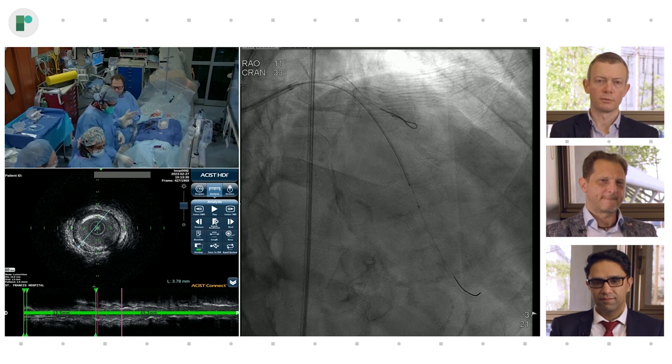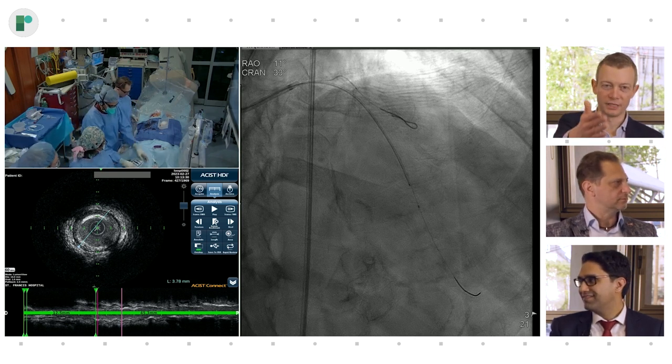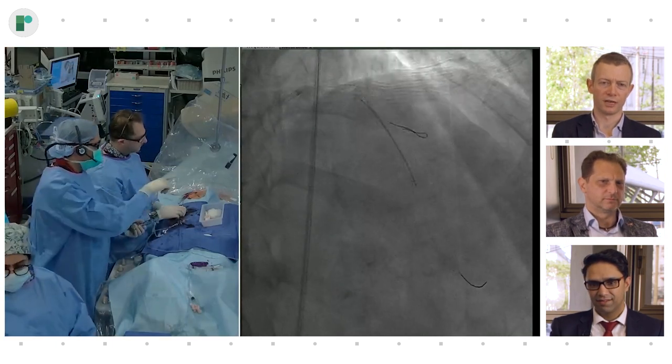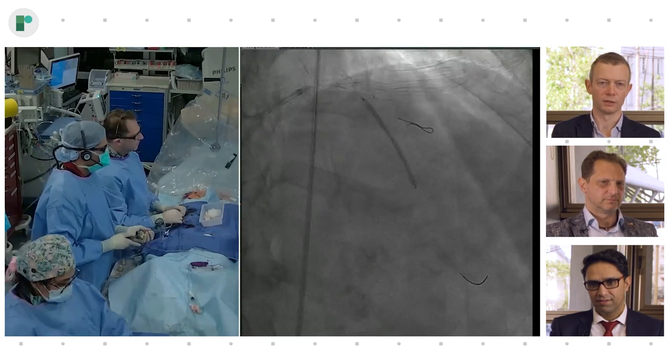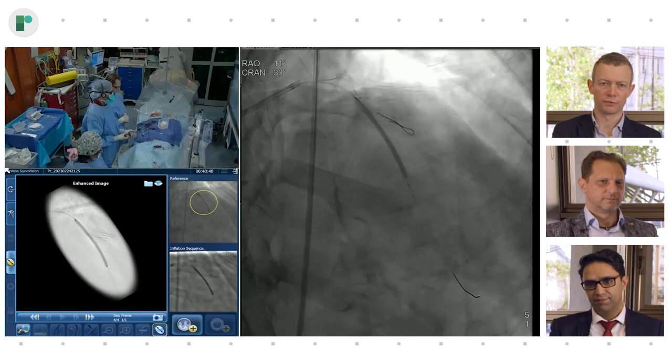It's a nice comment, by the way, on using the rubber side of the syringe, right? I mean, this system is equipped with a touchscreen. So if you have a nurse or a technician in the lab, that's very easy. But if you don't have one, there's a lot you can do yourself, right? Here goes the 2548, I think.